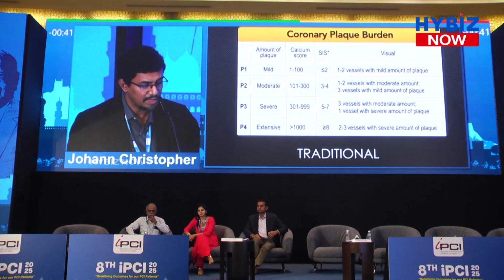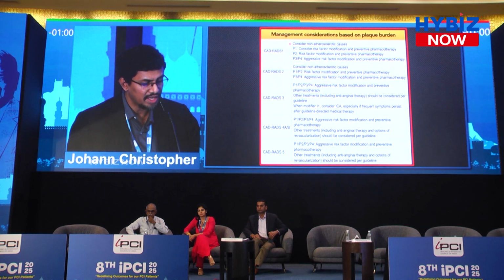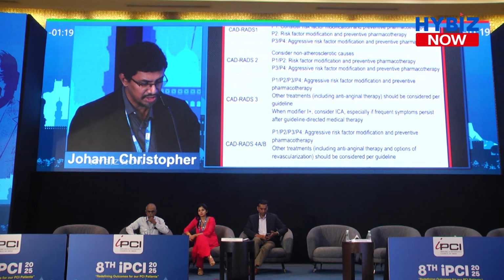We are also looking at plaque, which means calcium, and we have a number, and we are also looking at the non-calcified plaque after giving contrast, and that's graded from P1 to P4, where P1 and 2 are mild to moderate plaque, and P3 is significant, and P4 means you have plaques in almost all the territories. So if you can combine the CADRAD with the P value, then you again have a very good management plan. So CADRAD 1 and 2 along with P1 to P3 is medical management, 3 is functional imaging along with medical management, and 4 would be an invasive angiogram with or without an OCT, and 5, as I said, would be viability along with an intervention.